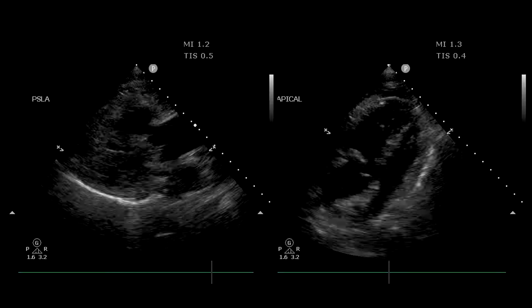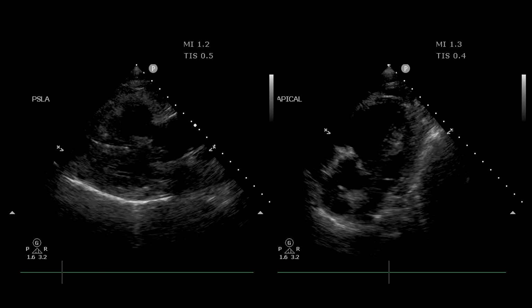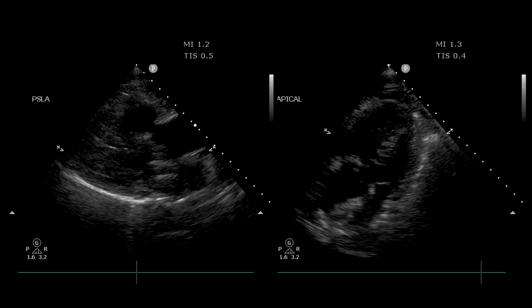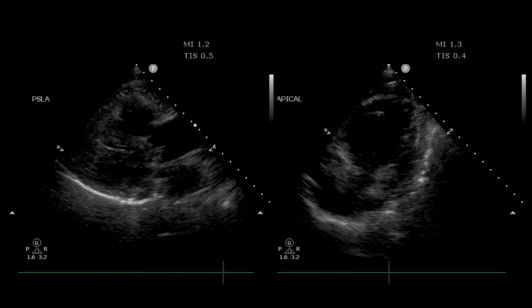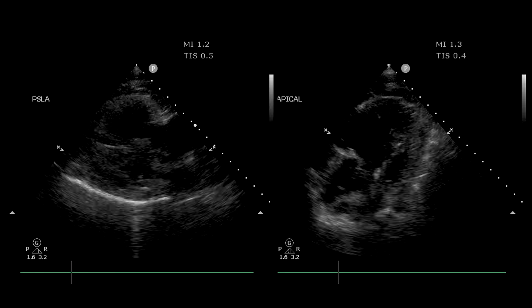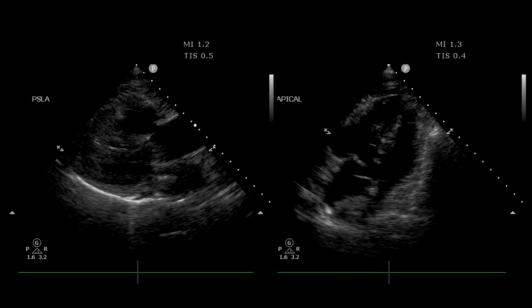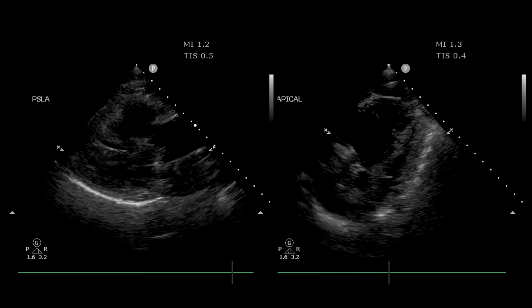And so it's really important as you do your scanning, as you try to estimate this left ventricular ejection fraction, that you find the window where the left ventricle is viewed in its largest, most full dimensions, right? You can do this rotationally, where you rotate your transducer to emphasize the right ventricle versus the left ventricle. You can also do this longitudinally if you are angled inappropriately, usually in the apical window.